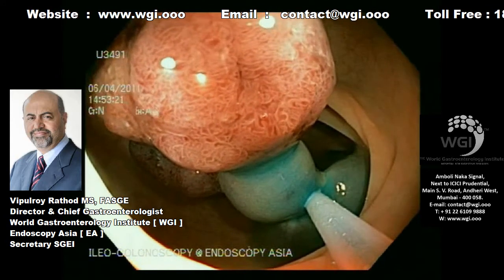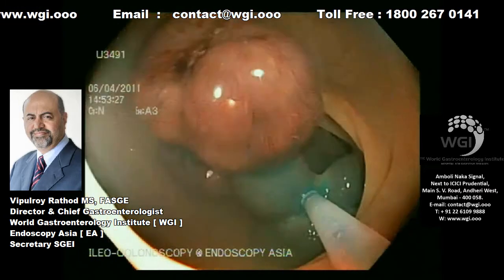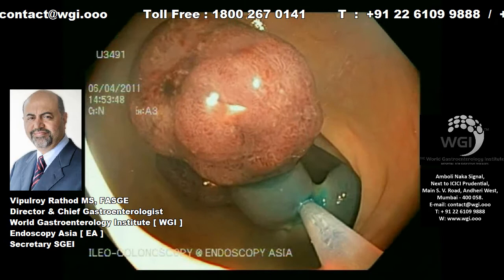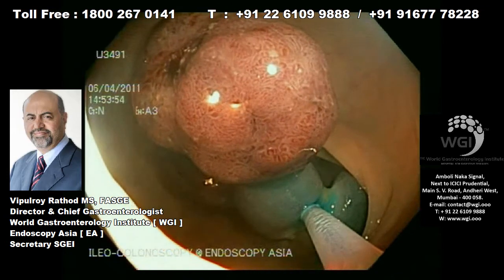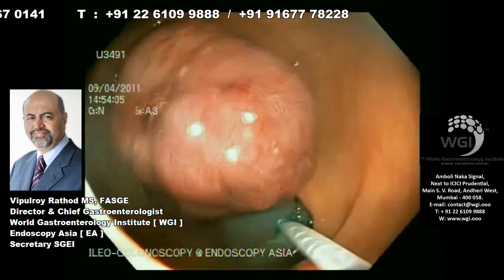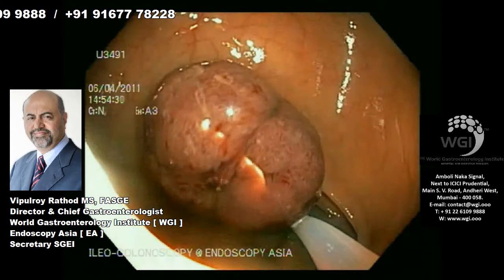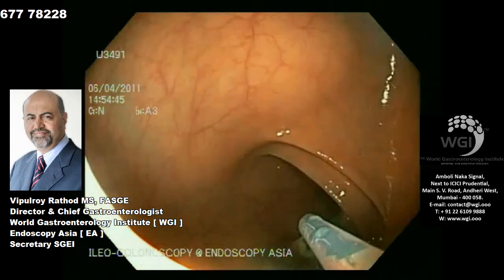Because the current will be transmitted, we then start polypectomy with ERBE cautery on endocut polypectomy mode. Very gently, in a step-by-step fashion, we apply the endocut and make sure the person giving traction on the snare does not cut through drastically. Very gentle traction and cautery application will lead to adequate resection of the polyp. You can see here — very gentle traction — and the polyp is now removed from the base.